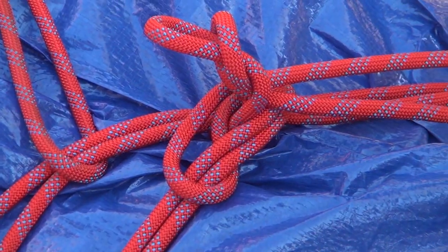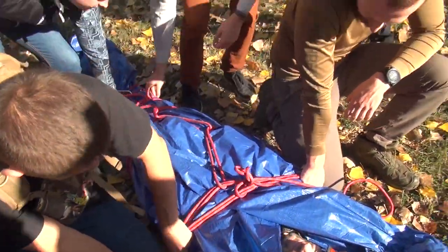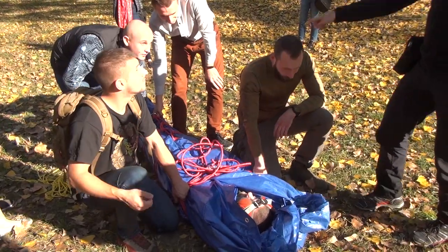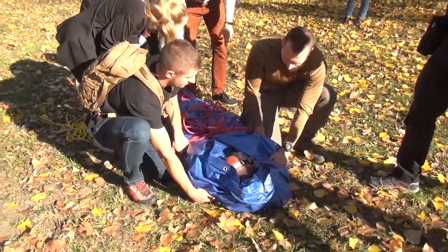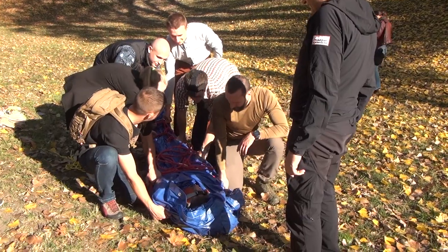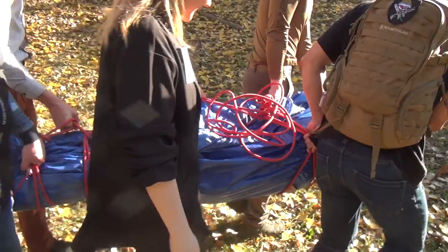Okay, now, three people on this side, and three people on this side. Come, help out. Yes? They always go in the direction of the patient to make sure that this one's really locked. Okay? Two more people, because you really need three people. Can one other person come and help? Can you help on this side? Okay. And then the person at the head counts. Three, four. Okay. And you can go back. Okay, go back.